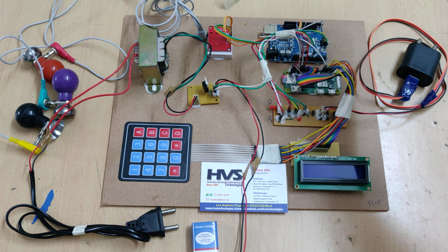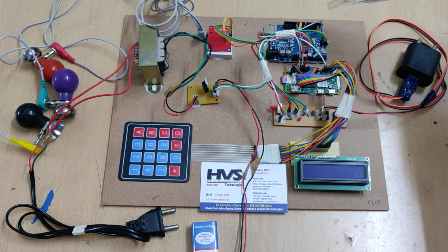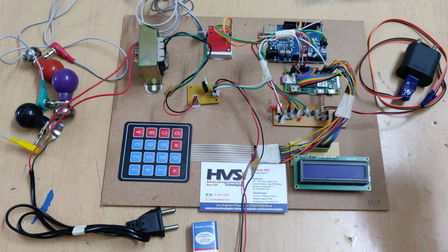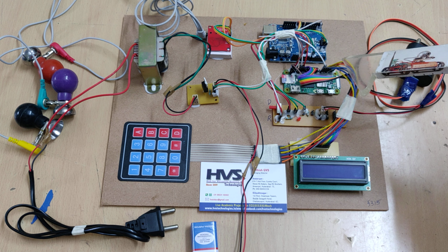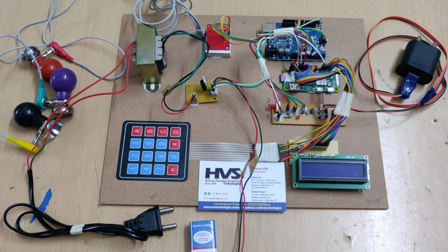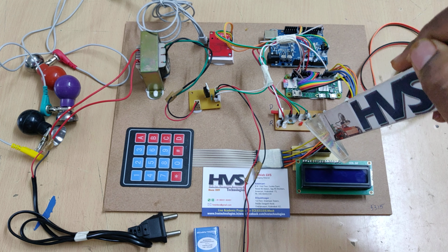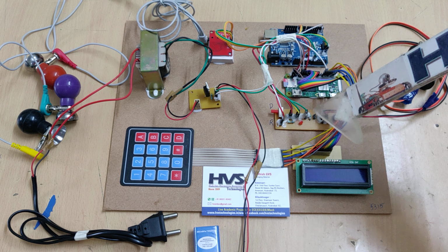As we have explained, the ECG connection to the UNO board is at pin number 10, 11 and A0, and the first pin is connected to the Raspberry Pi Zero 2W at the 15th pin. The LCD is connected at pin number 17, 22, 27, 9, 10, 11, and the Raspberry Pi is connected at 5, 6, 13, 19, 26, 21, 20 and 16. Next, the selection switch is interfaced at pin number 12, and also one more LED indication, which shows the status of the Raspberry Pi booting successfully done, interfaced at the 18th pin.